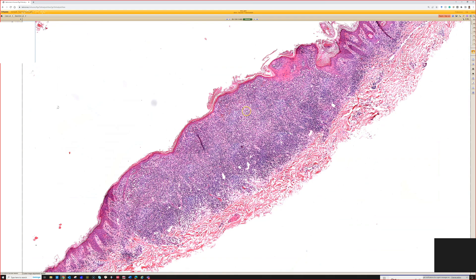If you do a MART-1 or other immunostain, it can make it much more obvious that there's a nicely structured, organized melanocytic lesion hiding in all the inflammation. It's hard to evaluate architecture when the inflammation is also dense. So if needed, you can do a stain to see the melanocytes better.